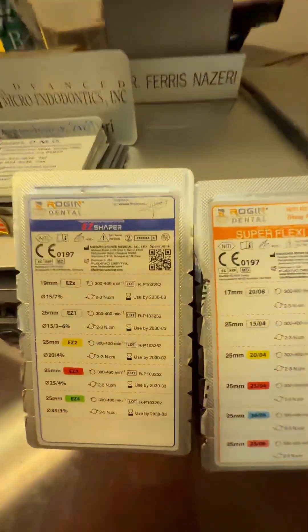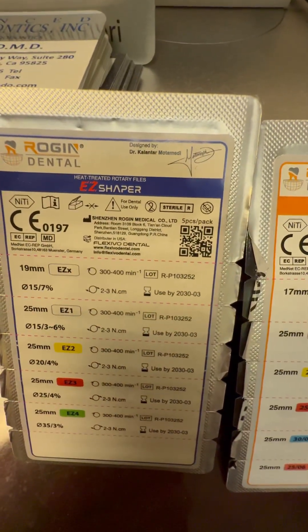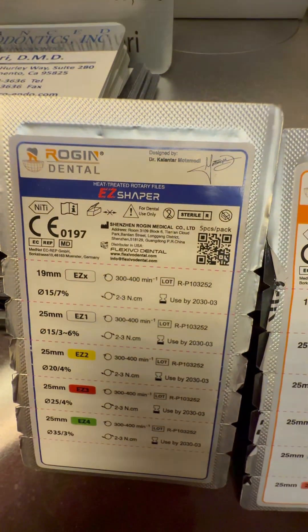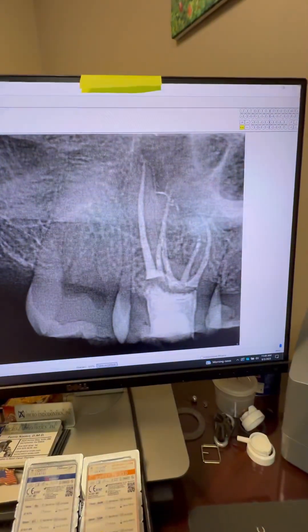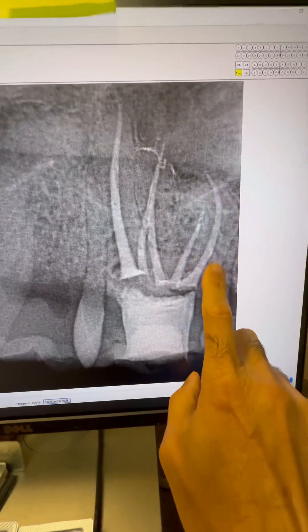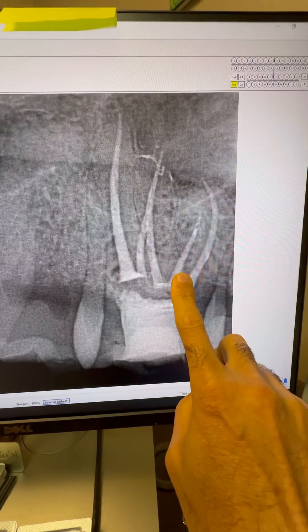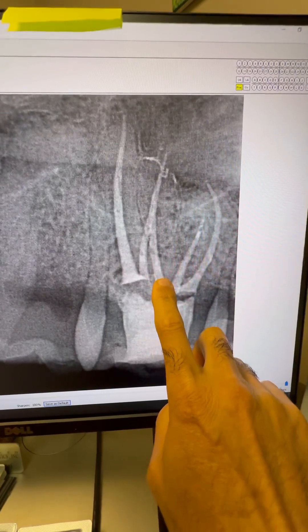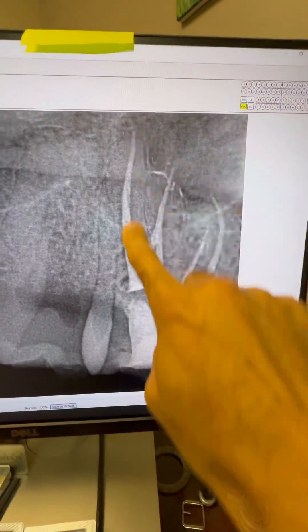I used the Easy Shaper files, which you can purchase from FlexivoDental.com. Here's another angulation where you can see MB1, MB2, DB1, DB2, and palatal.